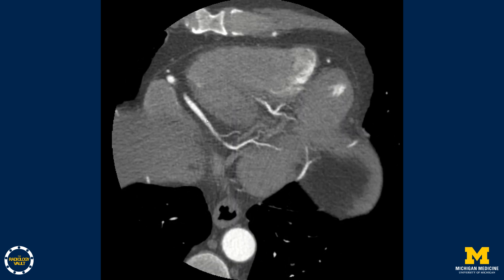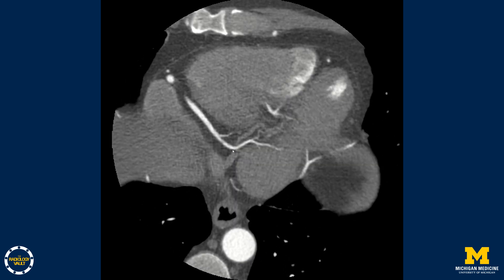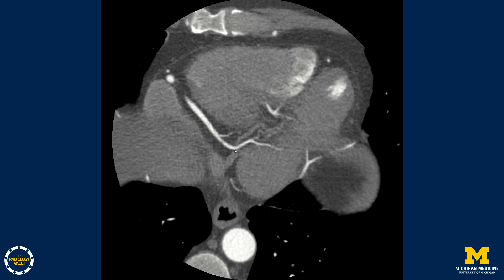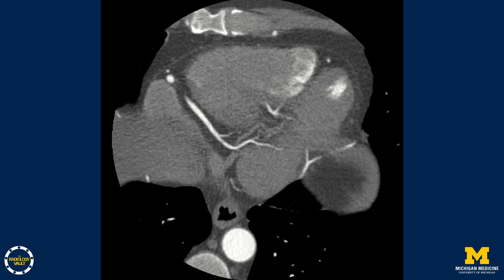Finally, as we follow the RCA inferiorly, it terminates as the posterior descending artery or PDA. This makes this a right dominant circulation, which is defined by which circulation supplies the PDA. In about 80% of people it will be right dominant, and the other 20% will be split between left dominant circulation from the left circumflex artery or co-dominant circulation supplied by both the right coronary artery and left circumflex artery.